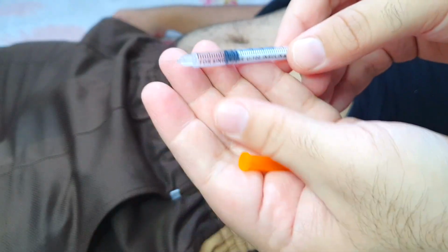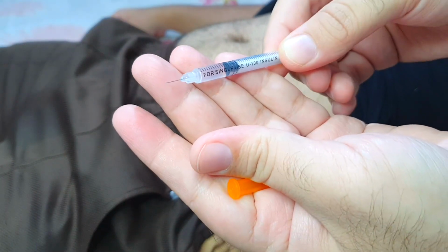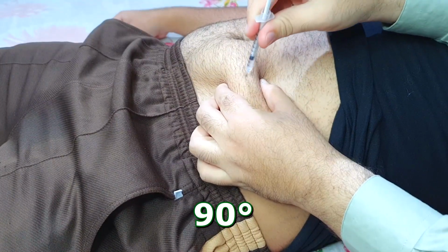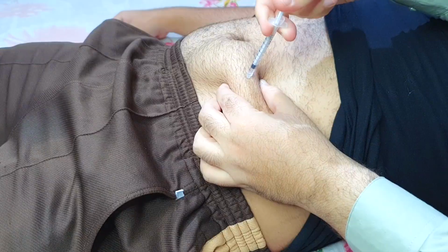This is the 1 ml syringe with non-removable needle. I will be using it here for my first demonstration. Pinch the skin, insert the needle at 90 degrees, inject slowly and then withdraw the needle.